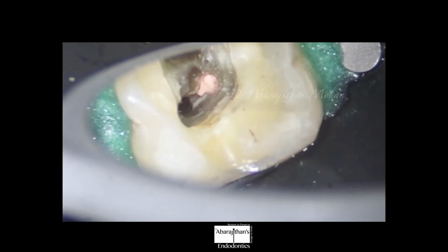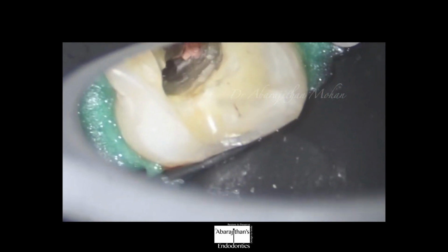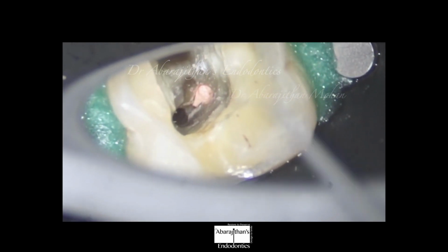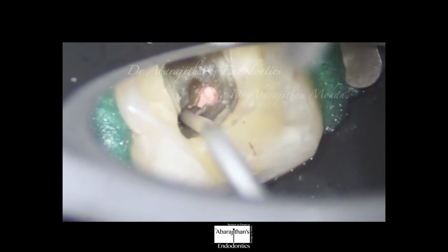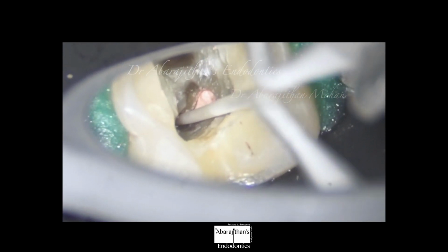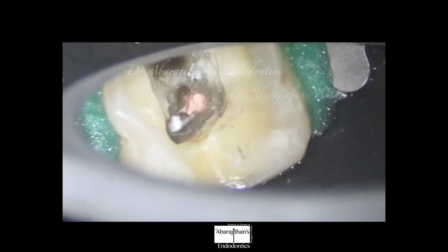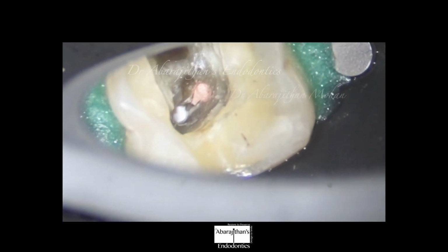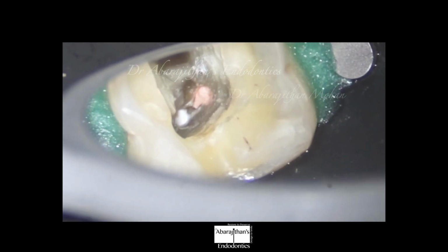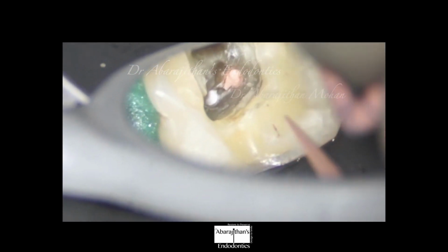You can see this is a mandibular second molar, which is often dreaded for the difficulty of obturation, but with magnification and with proper ergonomics, you can see the mouth mirror is placed distal, and I'm only focusing on the mouth mirror so that you don't see the real teeth. It is what you're seeing, only the image. I'm able to place sealer with much control, and you can see how I'm going to do a down pack.